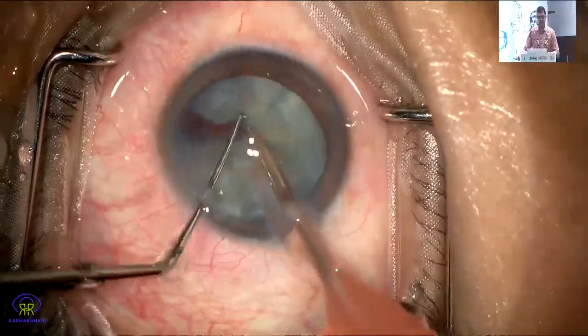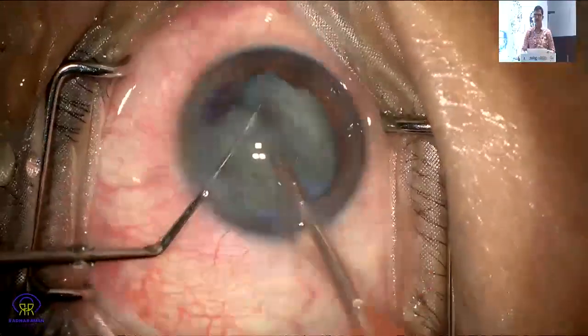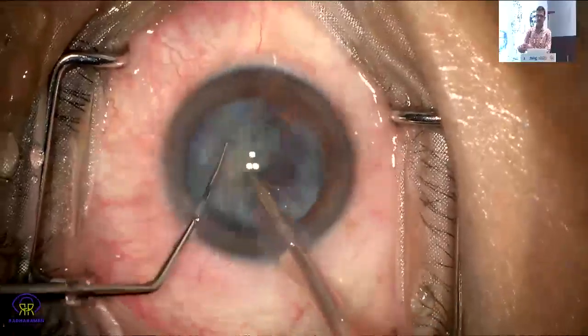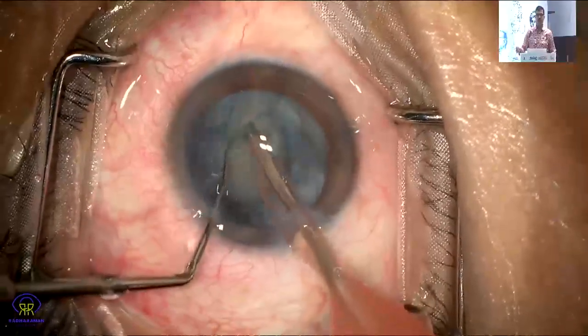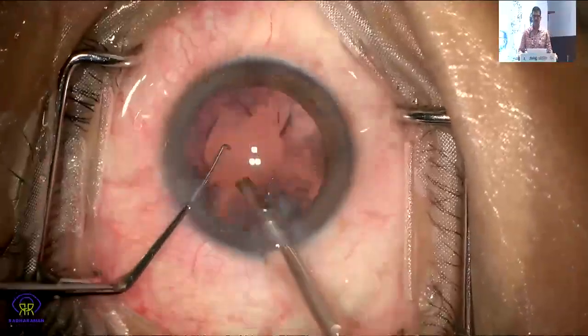Following was a slow motion phaco, downing your parameters. Fluidics are always low in my surgeries, whatever. So luckily the cataract was not very hard, all the while looking at the flaps, how they're fluttering, whether the flap motility sign is positive or negative.